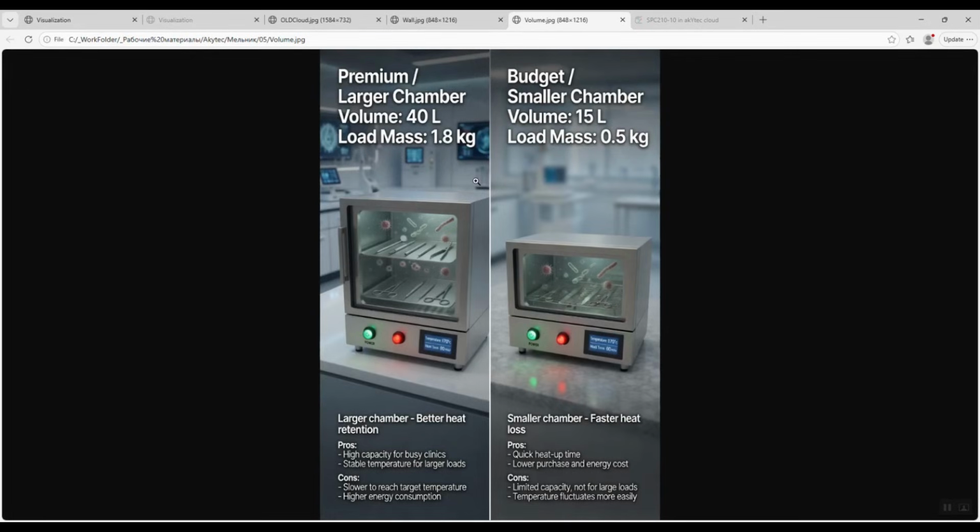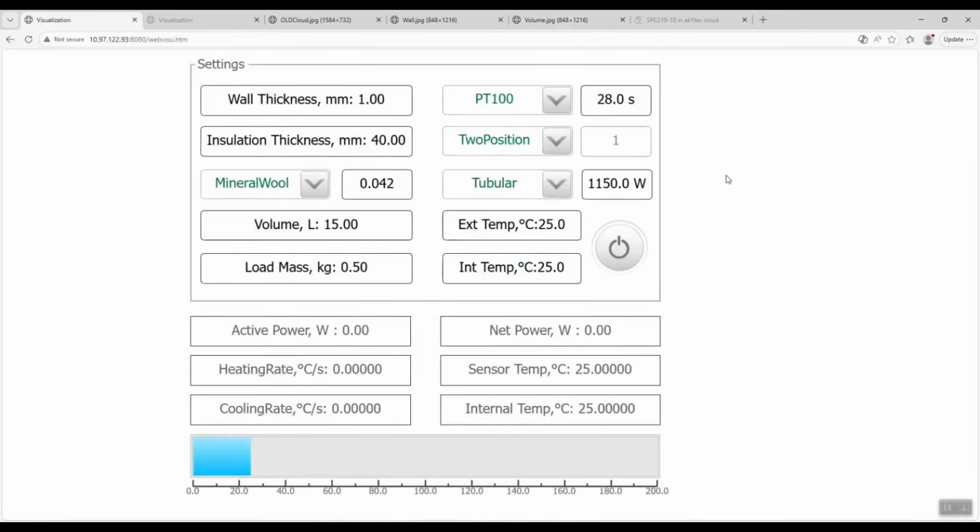The larger the chamber volume, the more instruments you can sterilize in one load, but the longer it takes to heat the chamber to the target temperature. As a result, you get higher energy consumption and cost compared to a sterilizer chamber with a smaller volume. The sixth parameter is the sensor type.